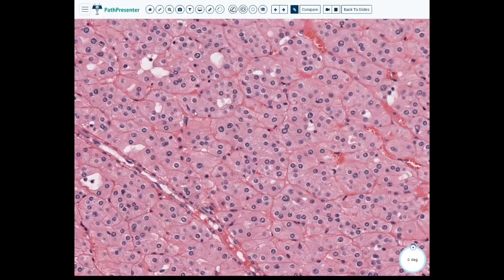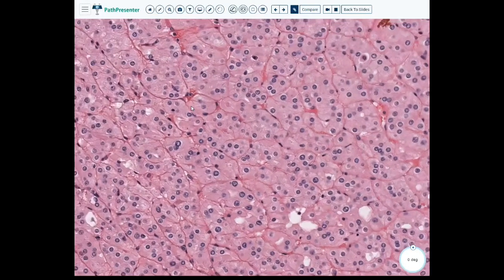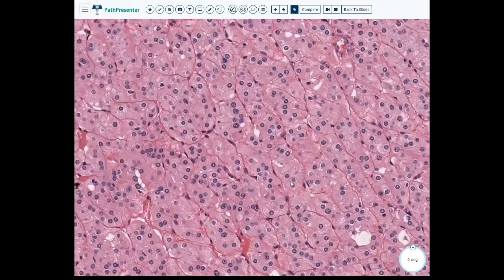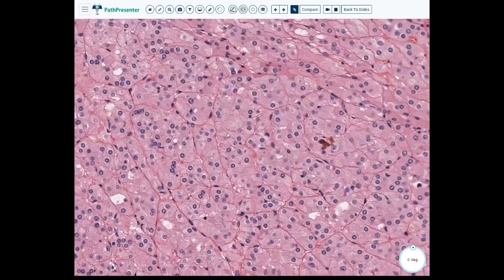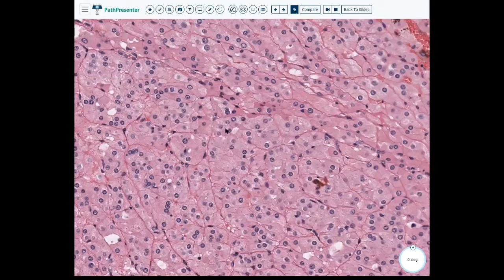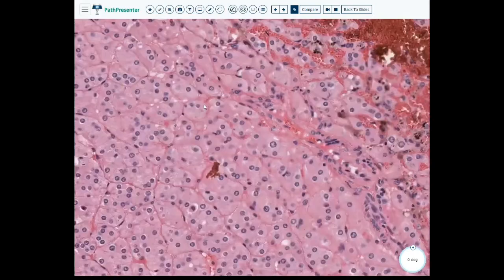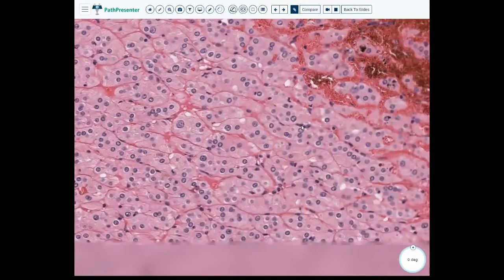In the lecture, I said that, even though you're not supposed to have halos, you do tend to see these areas of halos in these lesions, but they don't have koilocytic change. So what am I thinking with this? To me, this looks like oncocytoma, but it would not be unreasonable to be more descriptive and say oncocytic lesion, but this kind of fits the bill for oncocytoma more than other lesions.